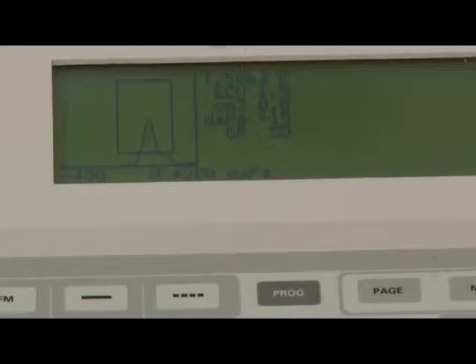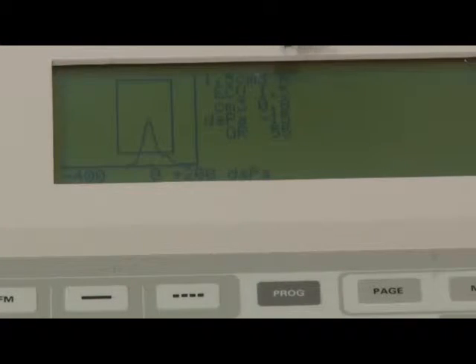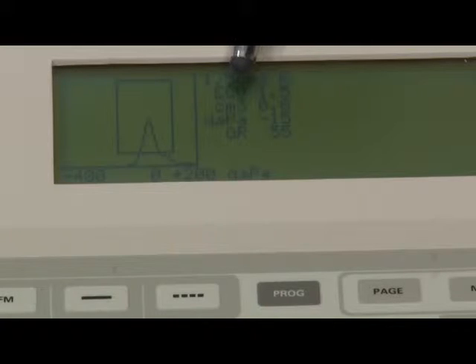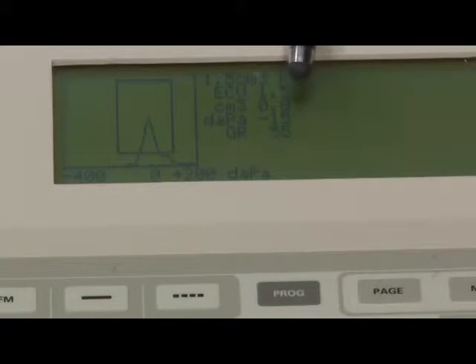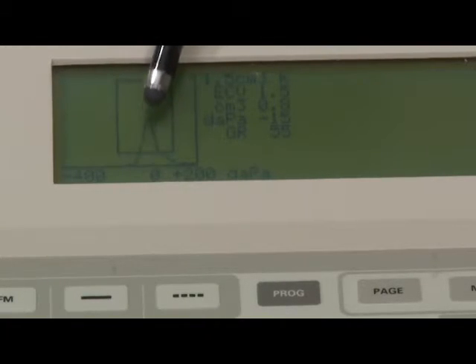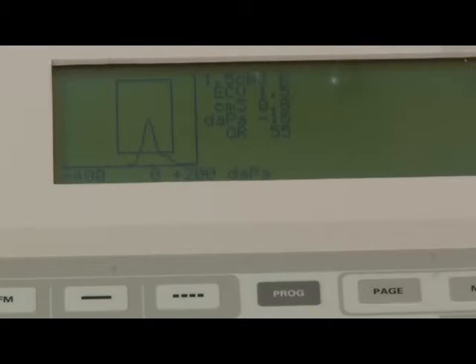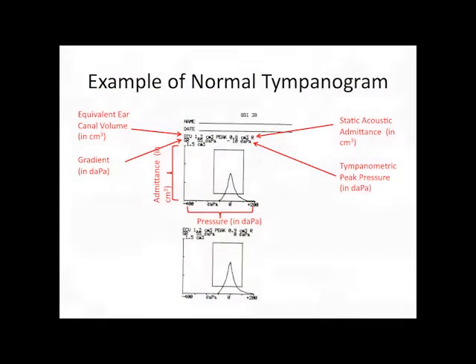This is an example of a normal tympanogram with an ear canal volume of 1.5, a static acoustic admittance of 0.8, and negative 15 decapascals. You can see that it has a peak there, and that's normal as well. After you're finished, you can print out the results. Here's an example of what the results may look like.